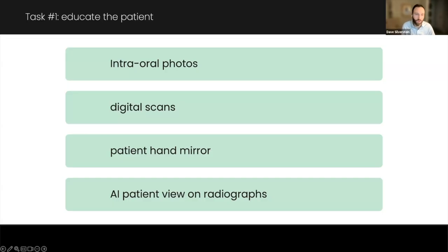So we use a lot of intraoral photographs. We use the iTero scanner all day. That thing probably has miles on those wheels by this point, just in my little office. Sometimes I'll get the patient mirror and say, hey, hold this up while I look at these. I want you to see these. And of course, the AI patient view on radiographs, like we talked about. And my hygienist is the one who's doing the preheating for this, right?